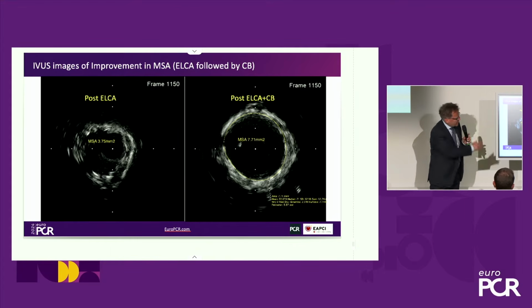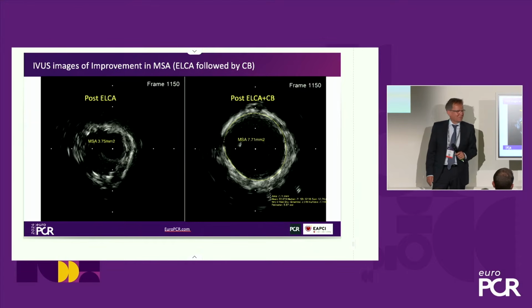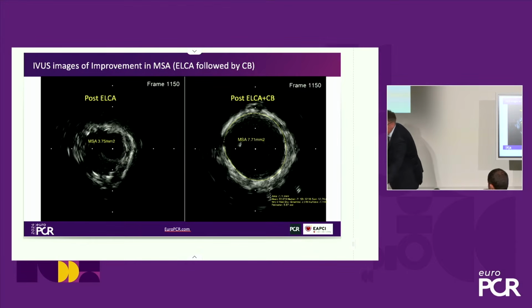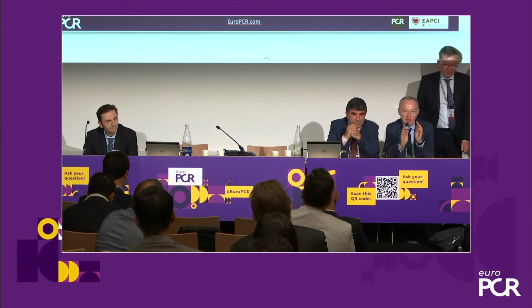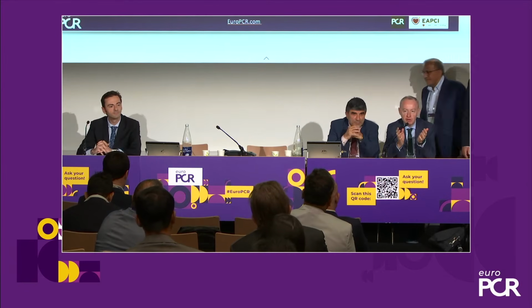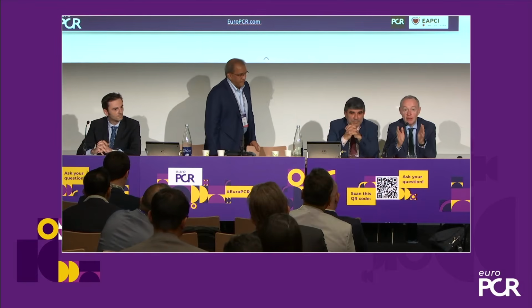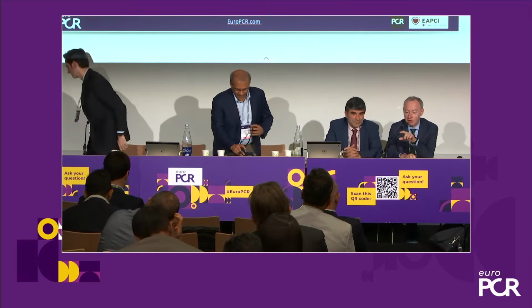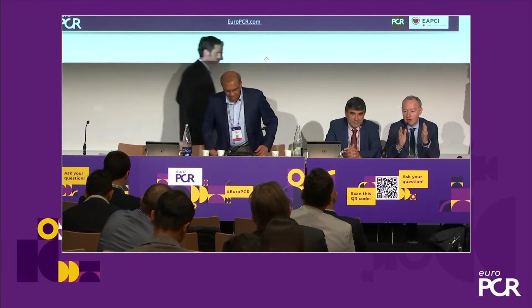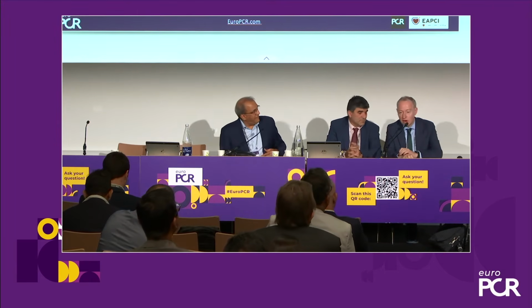And the reason why I think I congratulate once more Kiriti for a very nice presentation. I think the key on that slide is that space between the stent layers, which, if you think about other alternative devices, you can't remove. There's nothing else out there that's going to get rid of that material between stent layers. And that's where ELCA is different, because it does get rid of it. And that's why he's got such a great result with stent expansion. You can't even see there are multiple layers there. So we're on time. We'll hand over to Alfonso.